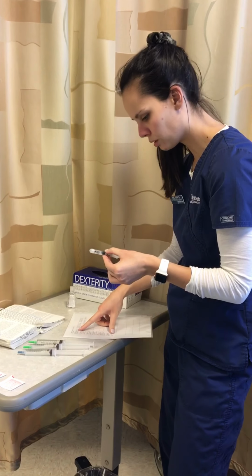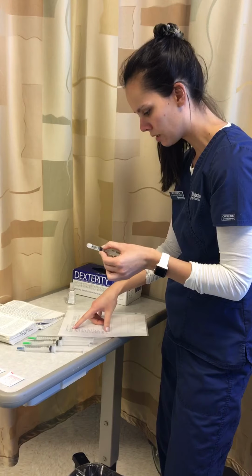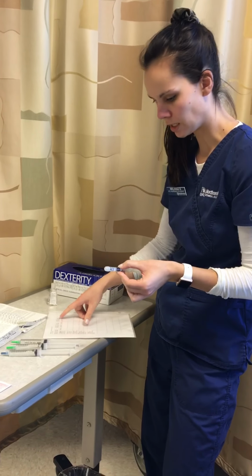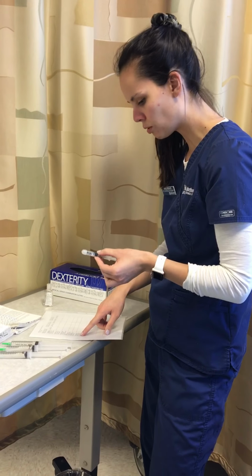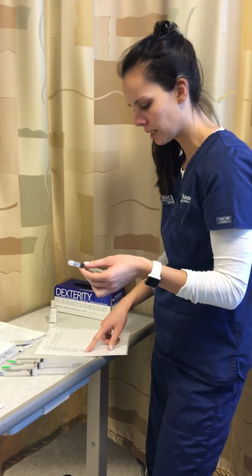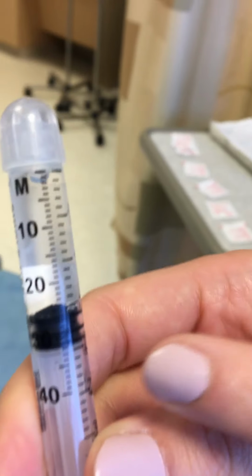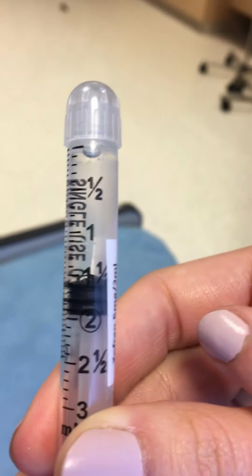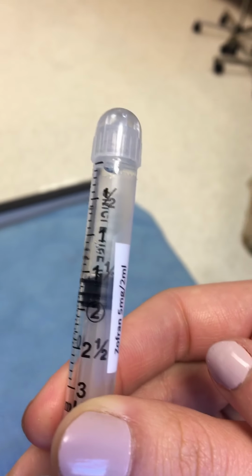And I will check my five rights here. So Mary Smith, 5/18/1963. She has ondansetron due for nausea, 4 milligrams equal to 1.6 milliliters. So I'll show you here. There's a few bubbles in there that I would get out.